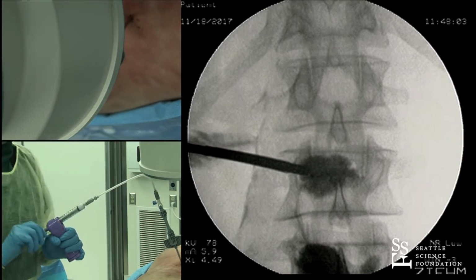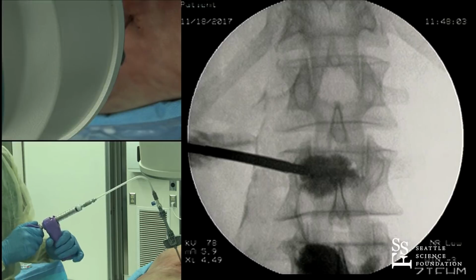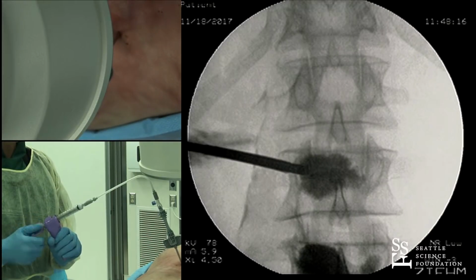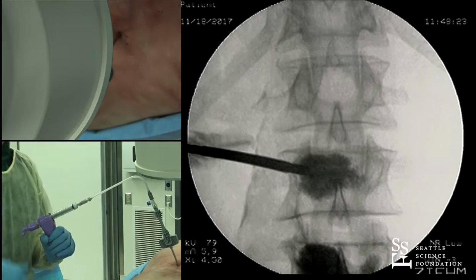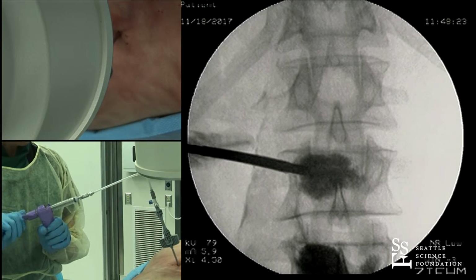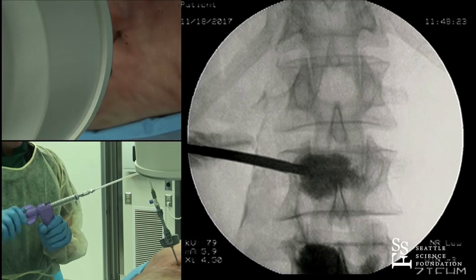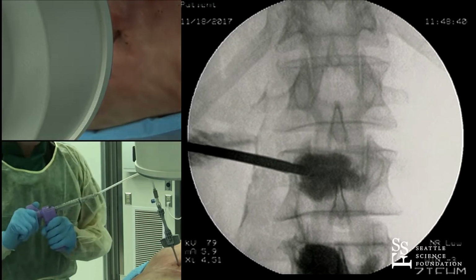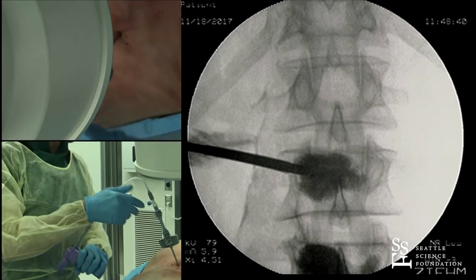Good. Doug, same parameters for judgment, end plate, pedicle to pedicle? Yeah. You know, the advantage of the implant is when you put an implant in the vertebral body, it helps support it. So the distribution of cement we find is not quite as important with the implants as it is with just regular balloon kyphoplasty, because in this and the CAST trial, it turned out it wasn't nearly as important to have as much cement to get the same results as it was compared directly to balloon kyphoplasty. There's quite a bit less cement, but it provided as much support. It was a non-inferiority trial.